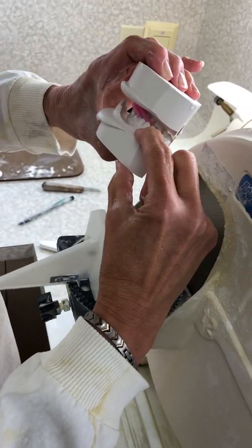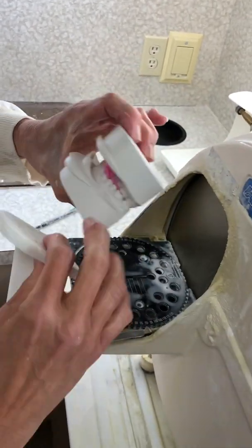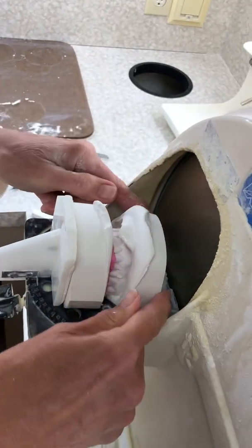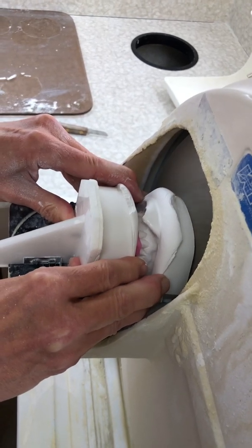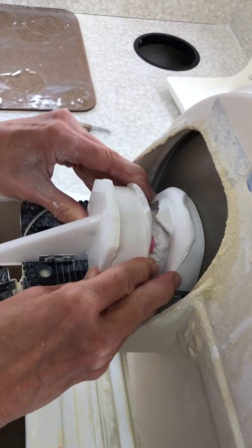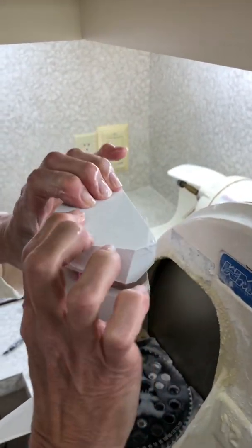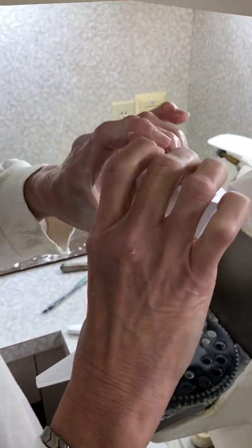So when I'm doing this, you keep an eye on that, but you also want to make sure that the top and the bottom are about the same distance. All right, so my top is actually a little bit bigger, so I'm going to flip it around, and it shouldn't matter which way you go now because they're parallel with each other. And I'm going to go in and take down some of that. Now we're at 75, so we've got about 5 more millimeters to go. So when I look at that, we're getting pretty close now. As you can see, now I've basically taken off that edge. I've got a little tiny bit there, but that's no big deal. And that's all leveled off.